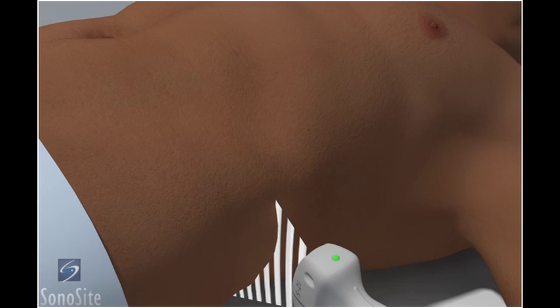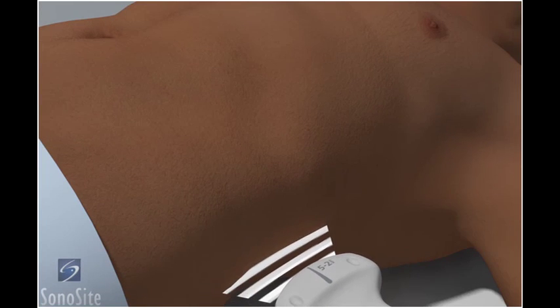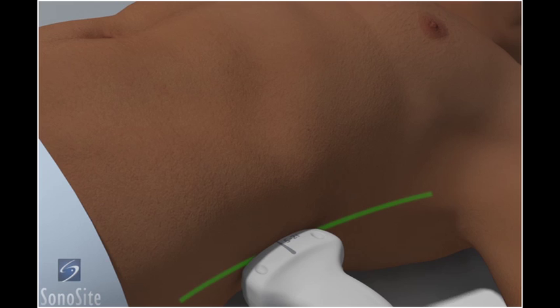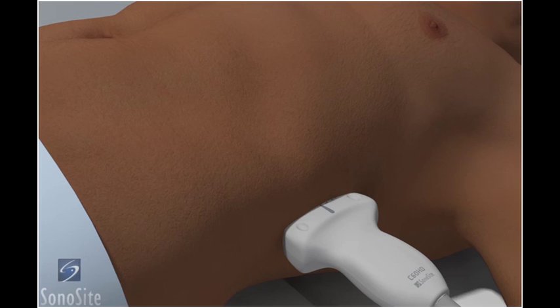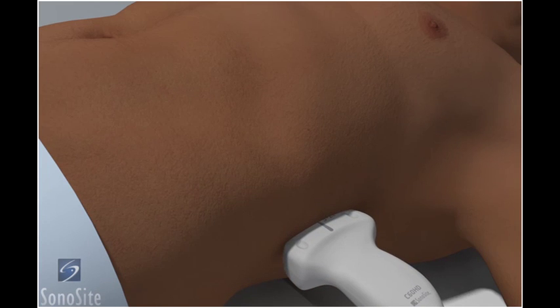The transducer is placed in a long axis orientation along the left posterior axillary line at the costal margin, with the orientation marker directed toward the patient's head. The left kidney lies more superior and posterior than the right kidney. Therefore, to adequately visualize the kidney, it may require moving the transducer superiorly to an intercostal approach and posteriorly from the midaxillary line.